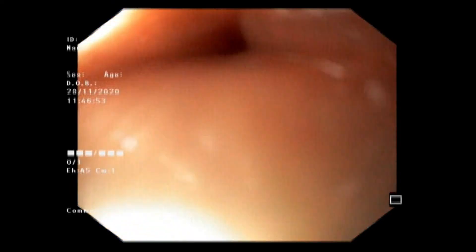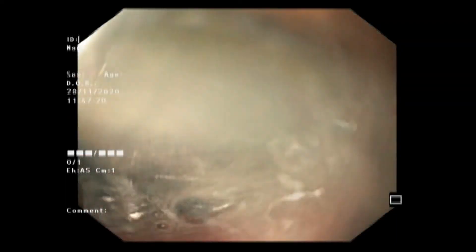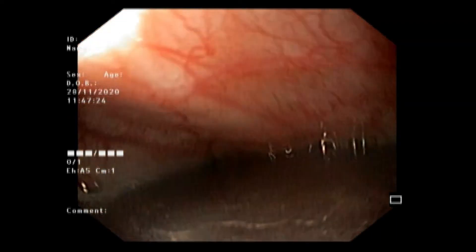When we were not able to negotiate through the cricopharyngeal constriction, the coin was released below it. We then passed the endoscope and pushed the coin down into the esophagus a little further, so we could get enough space to hold the coin with foreign body forceps.